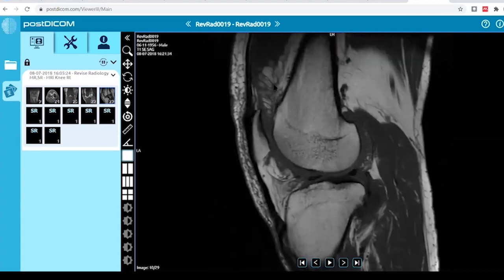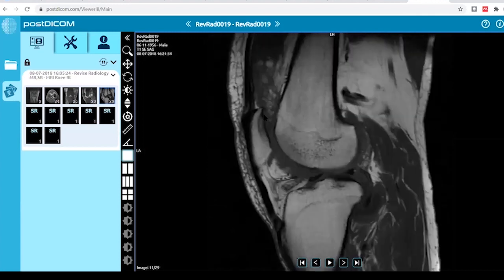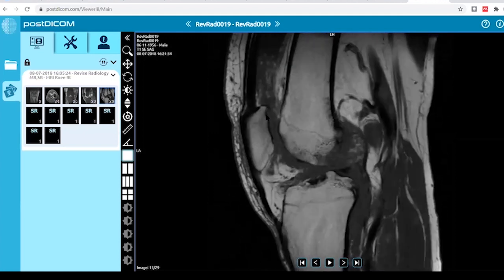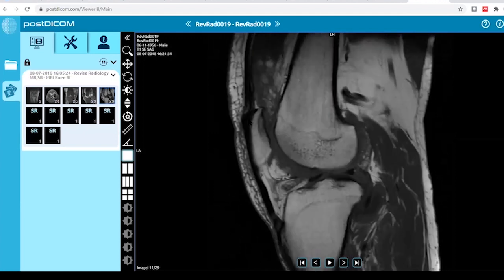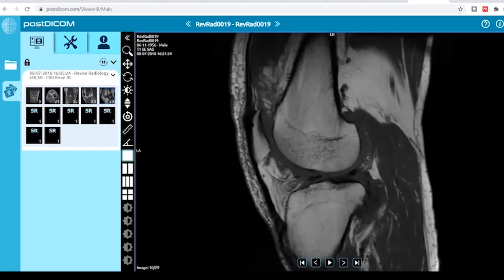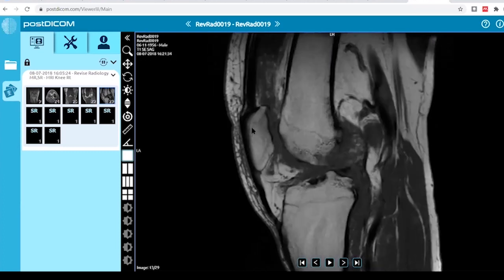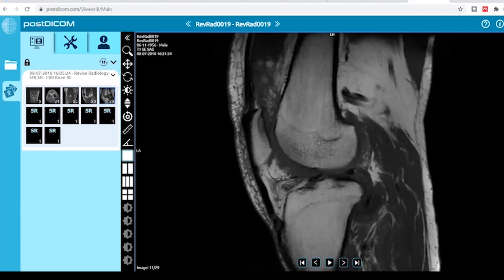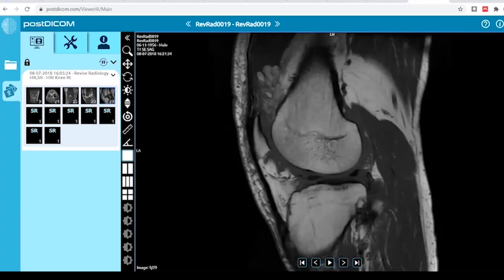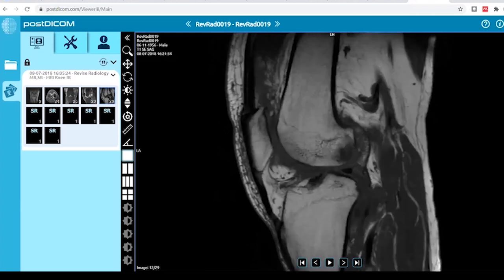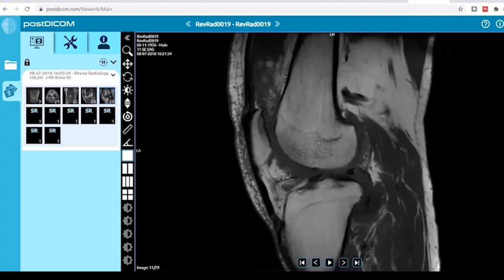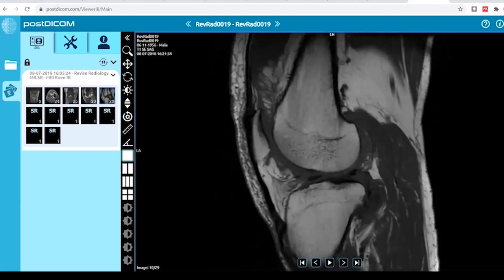You can see it here in the suprapatellar pouch — fat components are there. So with knee joint effusion, this is lipoma arborescens. These are synovial proliferative disorders. You have to make yourself familiar with these three or four diagnoses: PVNS, synovial chondromatosis, and lipoma arborescens.